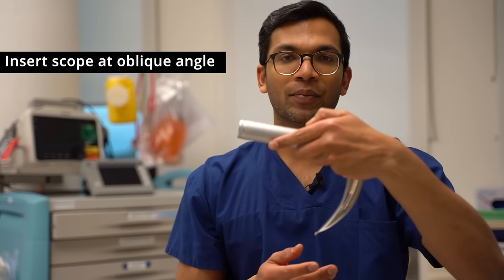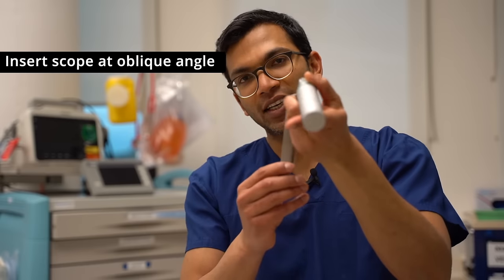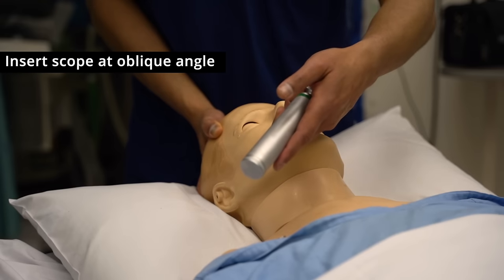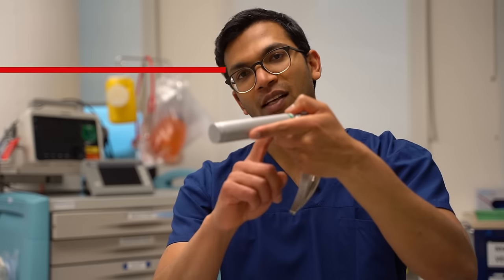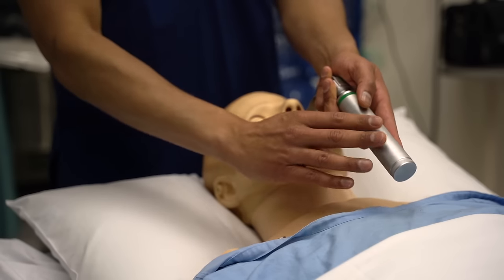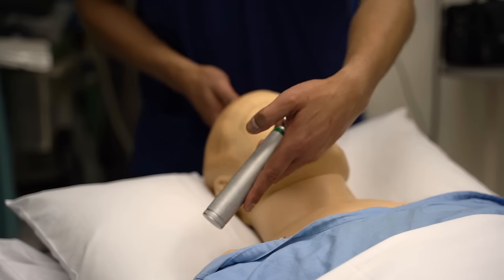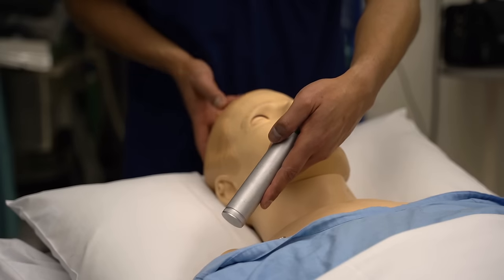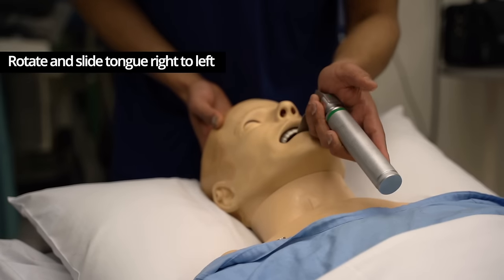At that point I then insert the laryngoscope. Most people tell you to insert it like this, but what I do is insert it slightly to the side. In some people this handle might get in the way, or the chest might get in the way. If I insert to the side, that's never a problem because there's always space, and once it's in I then tilt it around.